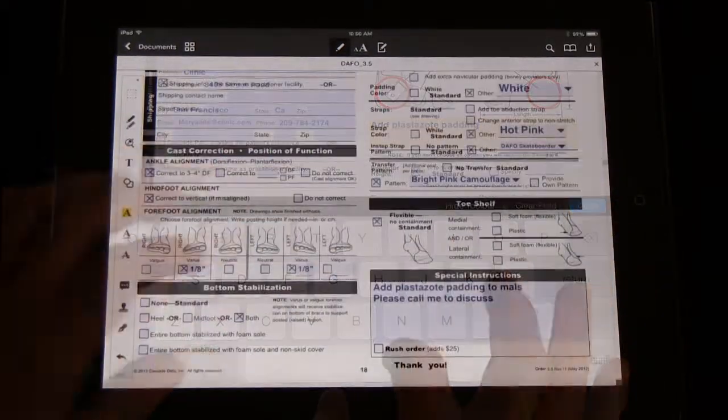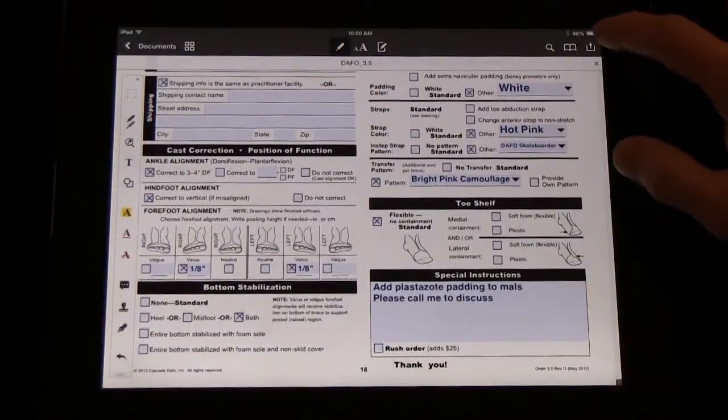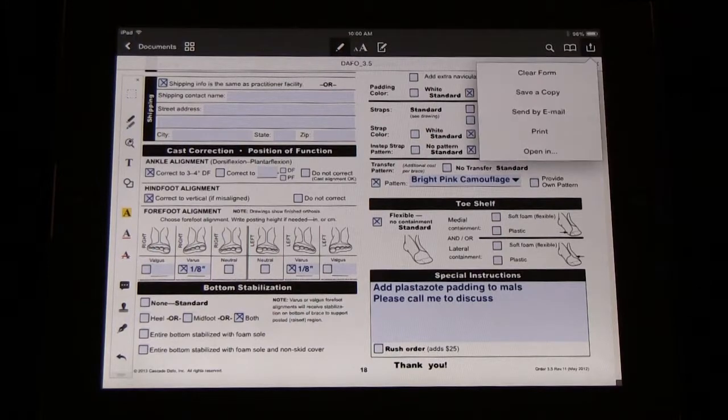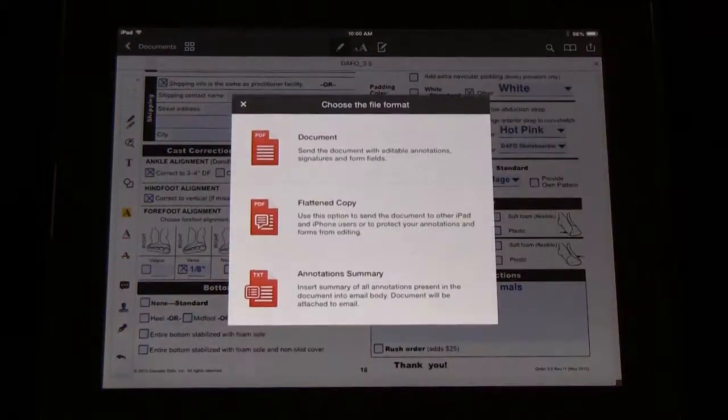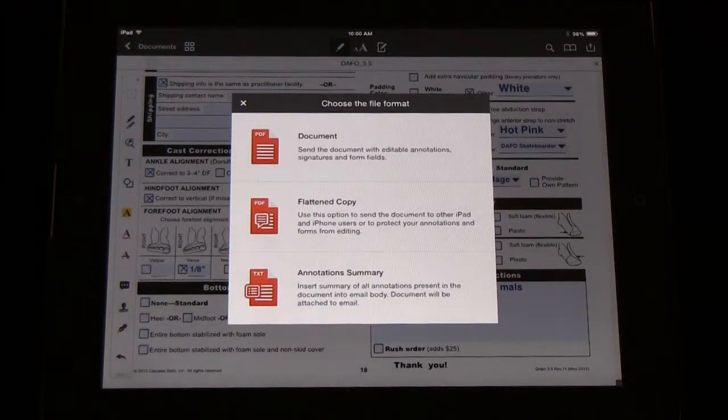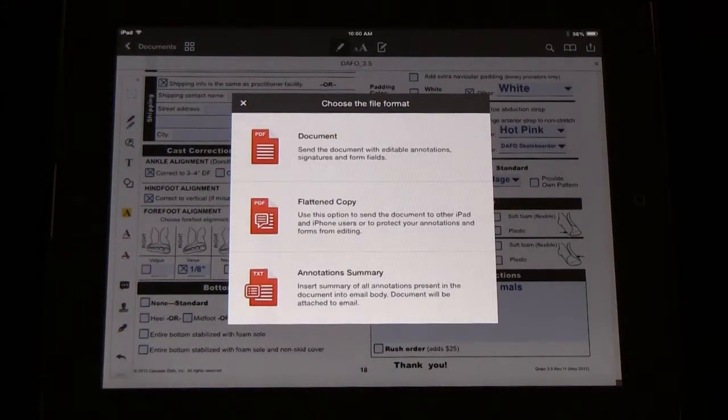Once the form is complete, email it to yourself so that it can be printed and sent in with the cast or uploaded with a digital order.